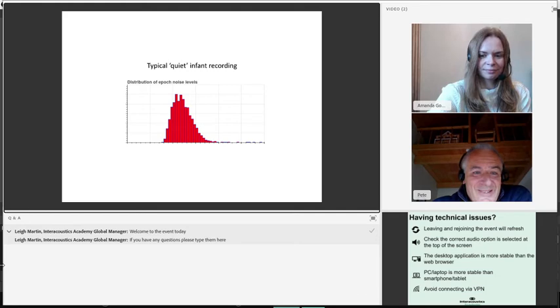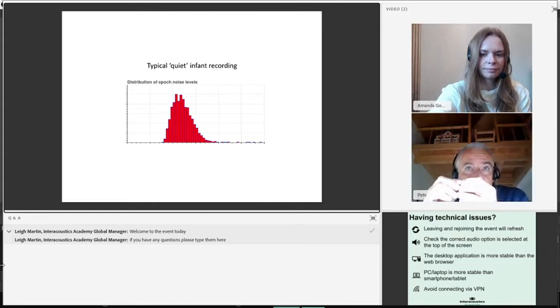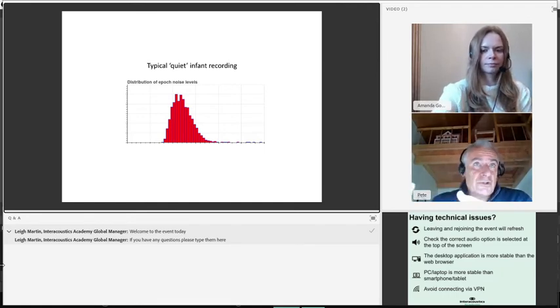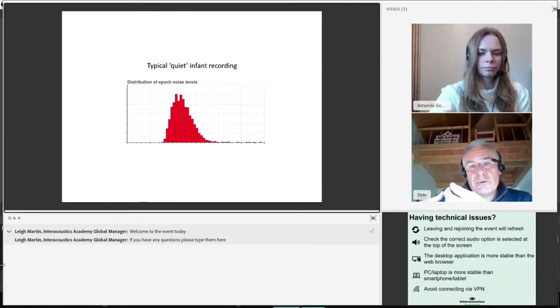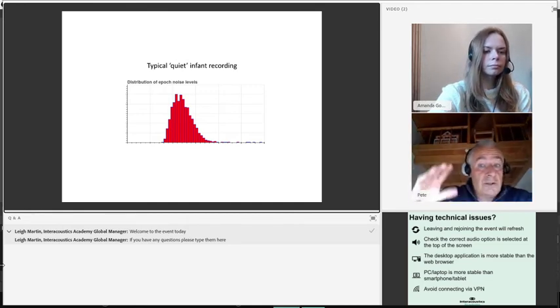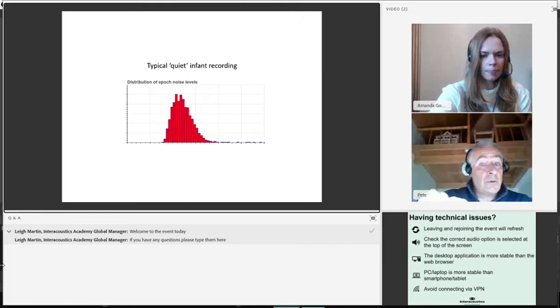Yeah, so hopefully this will answer that. When we are collecting data, most of the signal actually is noise. It's a lot larger than the OAE. Each time a response comes in to a click, in the case of TEOAEs, or the tones related to DPs, we're looking to see what the size of that signal is. And as I say, most of it's noise, and we reject it if it's too loud.